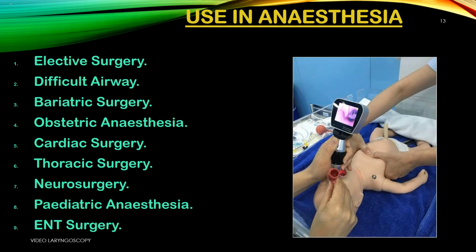8. Pediatric anesthesia. Small airways and unique anatomy. The magnified view helps with precise tube placement in children. 9. ENT surgery.